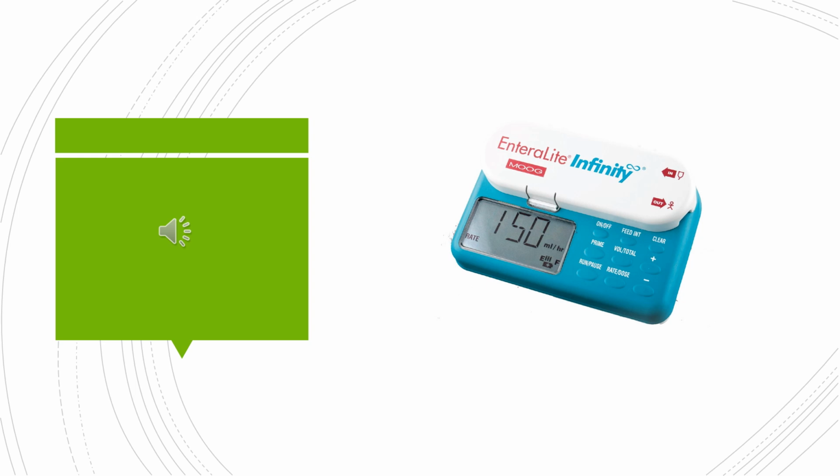Monitor battery life of the pump. Always plug it in at night. You don't want the pump to die if you're going on an outing or an appointment.